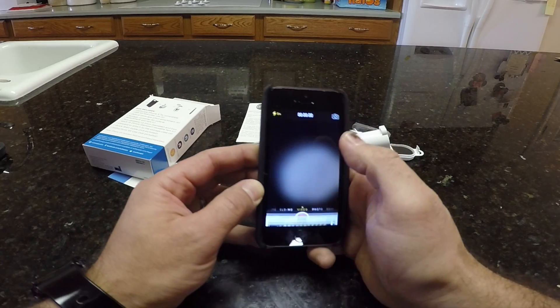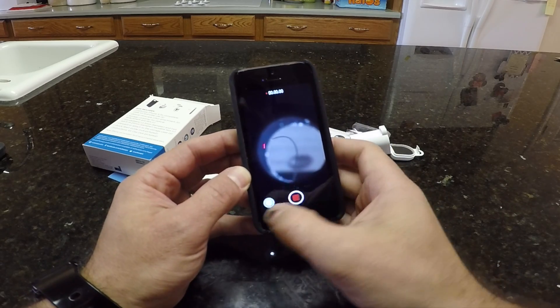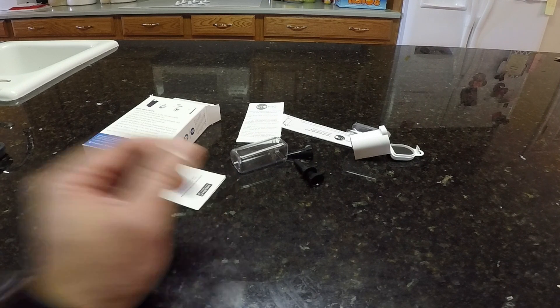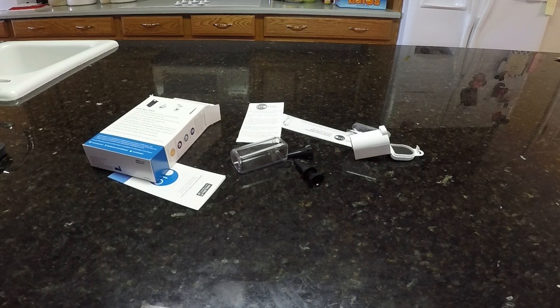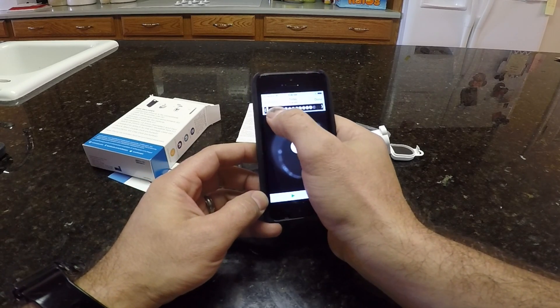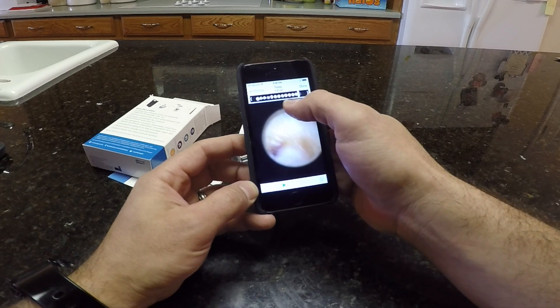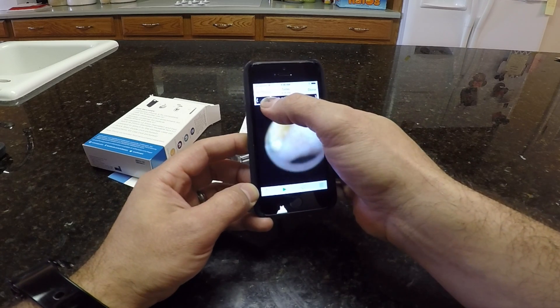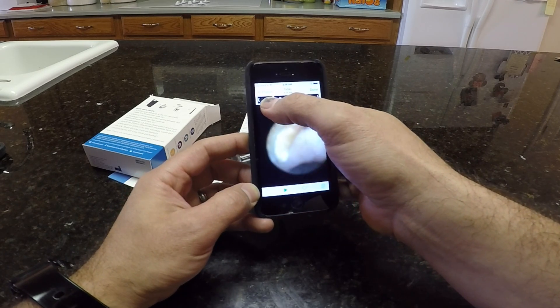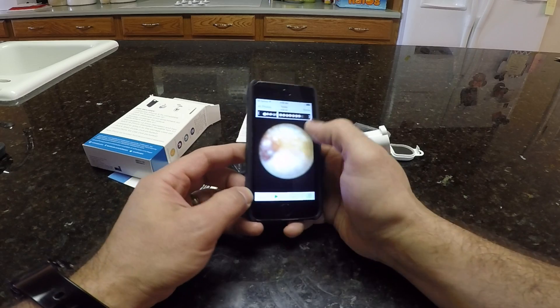All right, let's do another one. This one I'm going to point a little bit up. Let's activate the flash. And let's see if we get a better image this time. Yeah, so definitely you cannot do this blindly because you won't get any kind of view of what you want to see. All I'm getting is ear canal stuff, so that's not good.